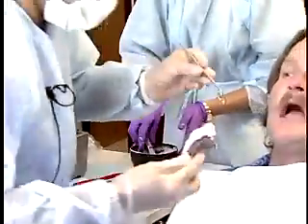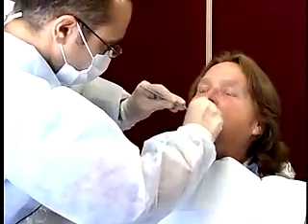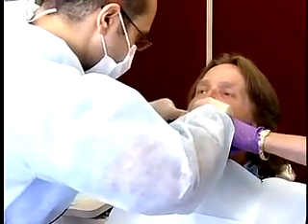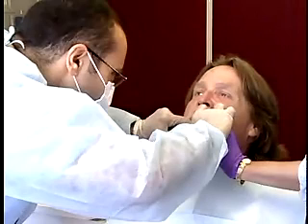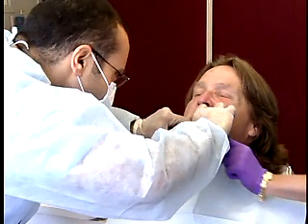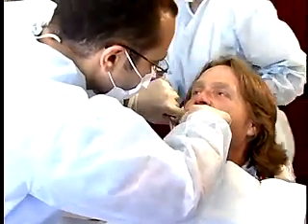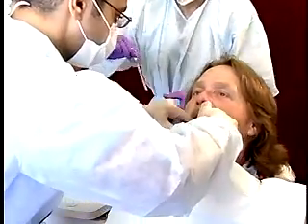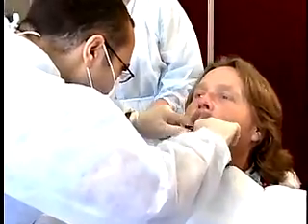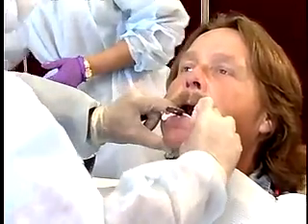Stand in front of the patient and place the tray at the left corner of the mouth. The right corner of the mouth is reflected with a mouth mirror. Center the tray over the residual ridge so that the tray handle is in alignment with the median line of the face. The lip is pulled out so the alginate flows into the labial sulcus. The seating pressure is stopped, and border molding is performed so that the impression is not overextended.